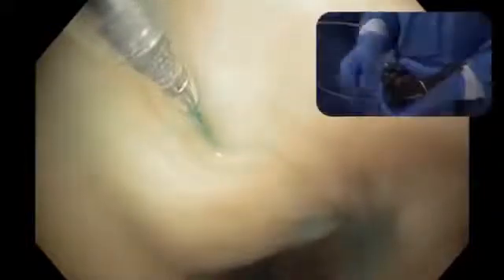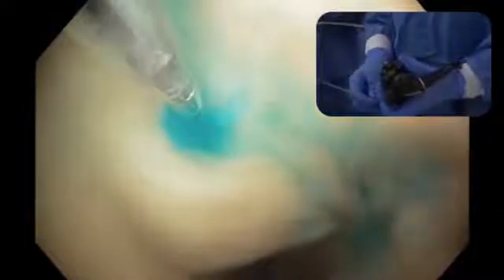So the first thing is just set it down on the location that we want to start our injection. And again, we've selected that location based on a strategy. And now we'll start the fluid into the tissue, and then just a little bit of popping motion will hopefully get it into the submucosa for us.